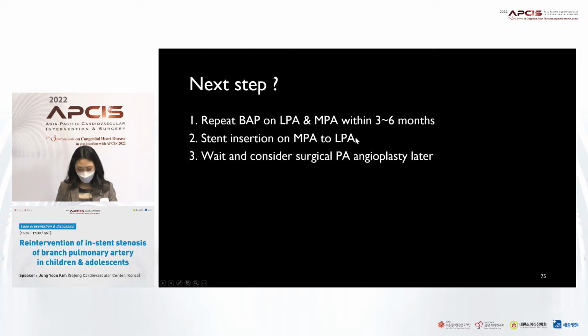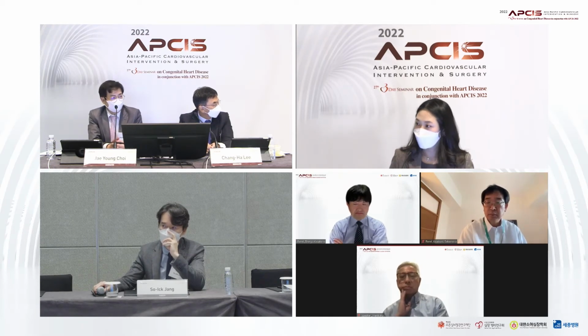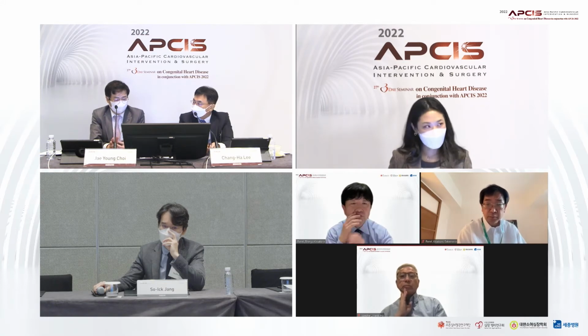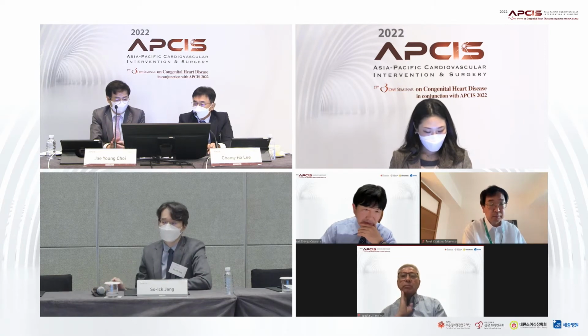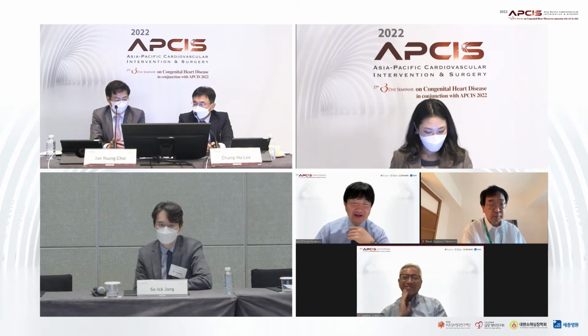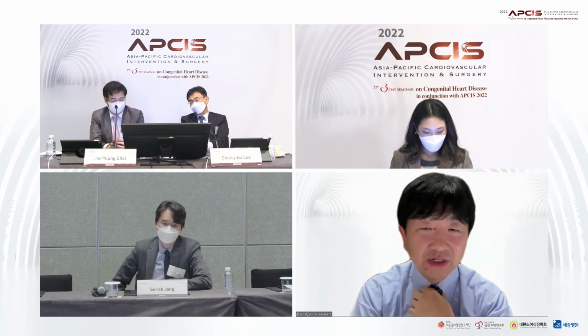In this case, did we have the EV3 stent at the time of presentation of this case? Yes, EV3 we have. Dr. Kasahara and Dr. Sakamoto, surgeons' opinion? I think that at first, the PA plasty surgically, and also some pulmonary valve needs to be competent. I think those 2 things are needed to get a good pulmonary artery tree, even in these cases. Dr. Sakamoto.